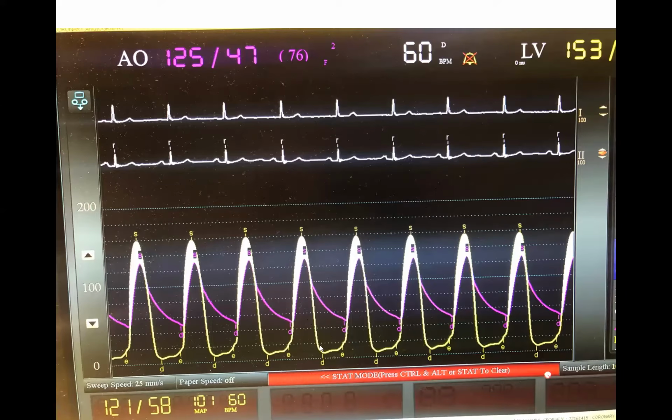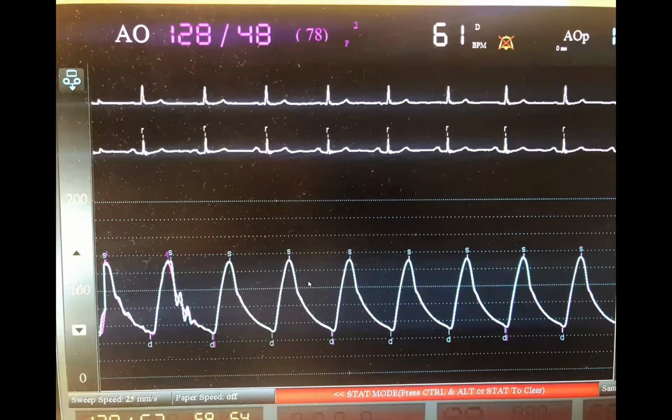So that's one issue with that catheter. And you can discover that issue by swapping transducers. When you swap transducer LV aorta, then you can notice that issue. The gradient may change. So always remember to swap transducer and always remember to verify the proper damping on pullback. If they are not properly damped, then when you pull back, the aortic lumen will be more damped than the LV lumen. So you'll have aortic tracings that are not superimposed.